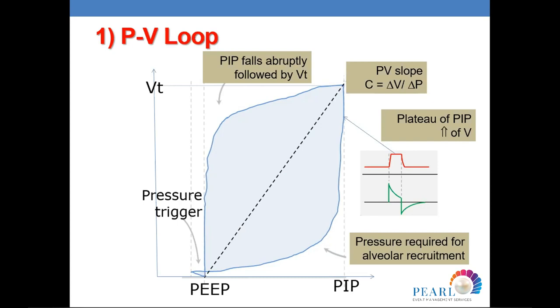And this is really helpful later on to, let's say, increase the PEEP. Maybe this patient is having a long time for the opening pressure, so I need to increase the PEEP to make it shorter. This is really helpful. And then it should go back in expiration. Then suddenly there is the closing pressure here, where there will be sudden loss of volume with little difference in the pressure. So this is, again, very important.